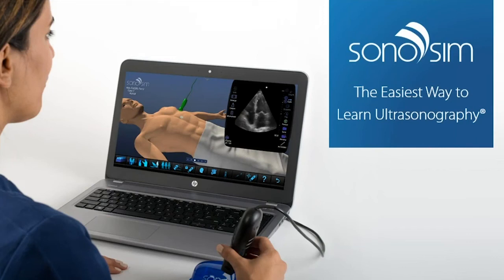I'm going to give you a little bit of background into SonoSim and what we're all about, and then going to dive into the technology, and I'm going to do my very best to help you make the most of it.